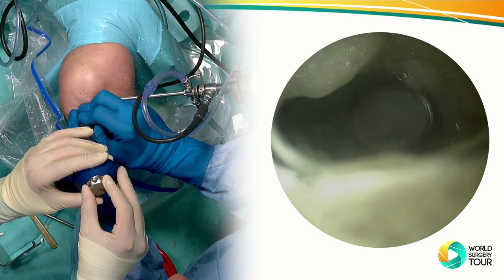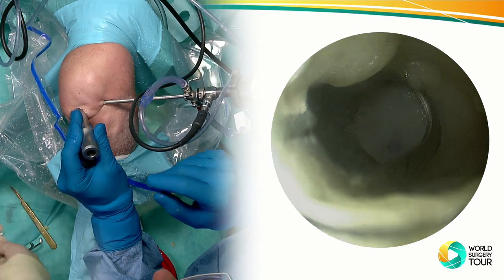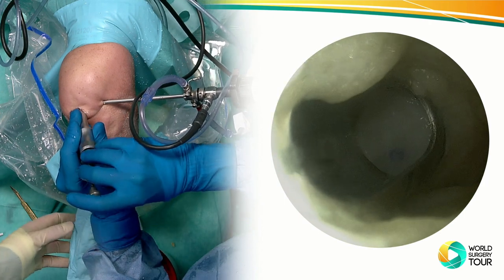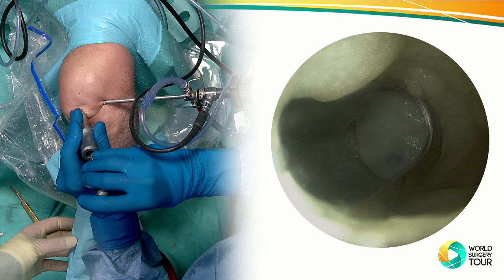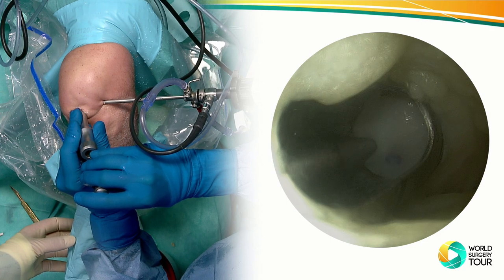Okay, good. Very nice. Now, can I have a palpation or something? Just to gently... So we gently... I think it's important that the recipient side must be dry. Really dry.